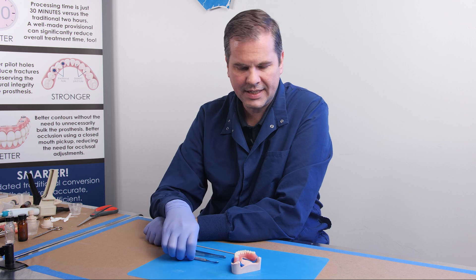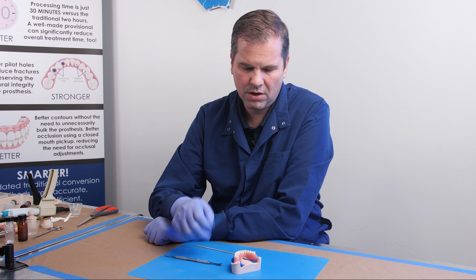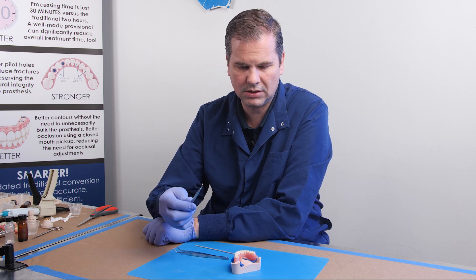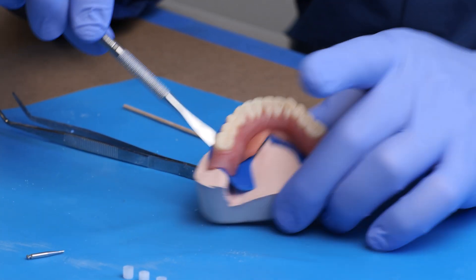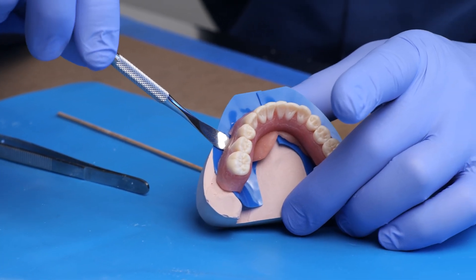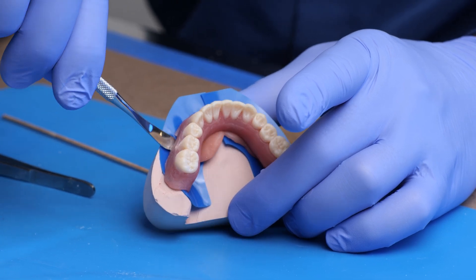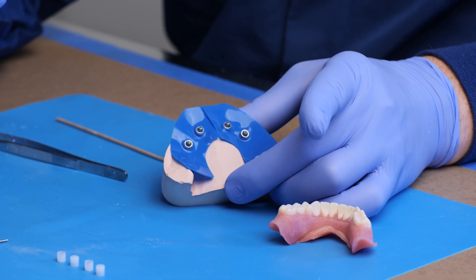To remove the denture, we can either use a periosteal elevator or the back edge of a cotton forceps. I'm going to go ahead and use this periosteal elevator. What you do is come underneath the flange — you can be right up against the bone if you're doing open flap — and you just give it a little twist and the denture just pops right off.